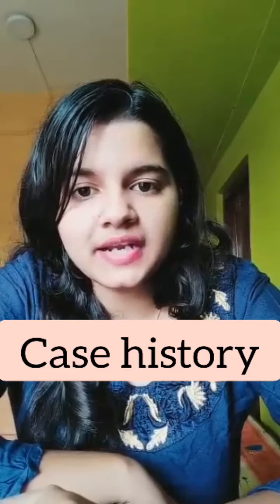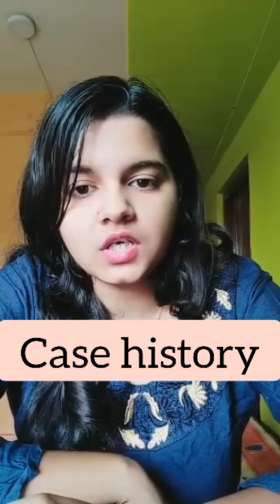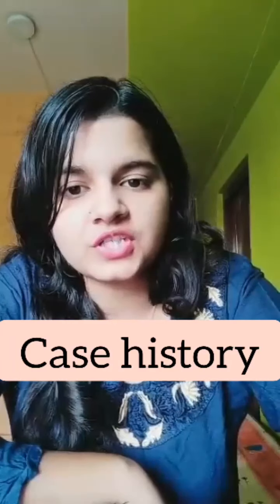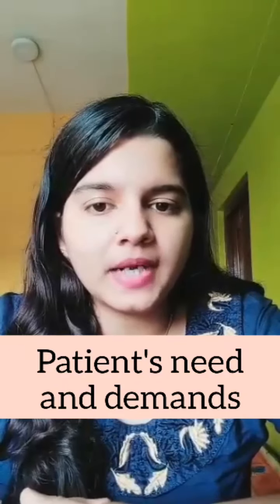So now let's talk about the case history. This is the most important part, as it helps us to decide what are the needs and wants of the patient. So the first thing that we'll check is the duration of the condition. We need to know for how long the patient has been having problems with the current spectacles, or for how long basically they are suffering from low vision. The most important thing is, what does the patient actually want from the consultation.